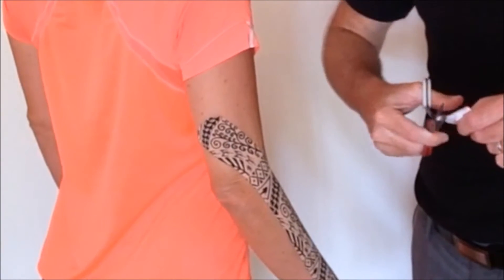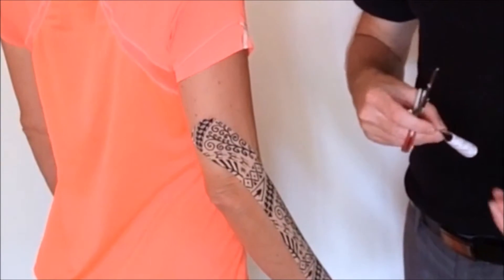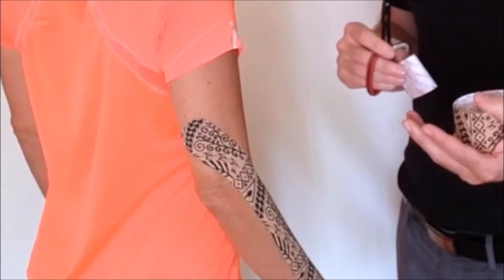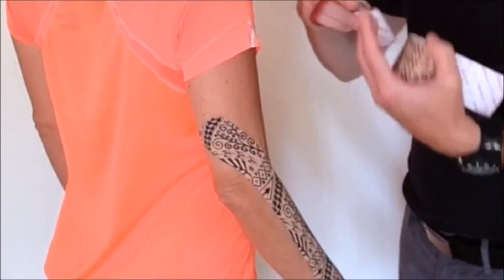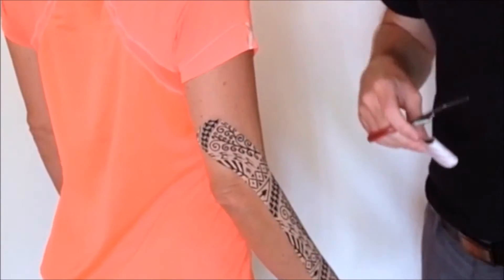Now with dynamic taping, what we're doing is more what you may have done traditionally with a rigid athletic tape — some of your McConnell type techniques where we're really trying to box up all of the soft tissue. So actually even in the length and position, everything is boxed up and we've got this big soft spongy area of all of the soft tissue, not just lifting those outer layers of the skin to create the space.